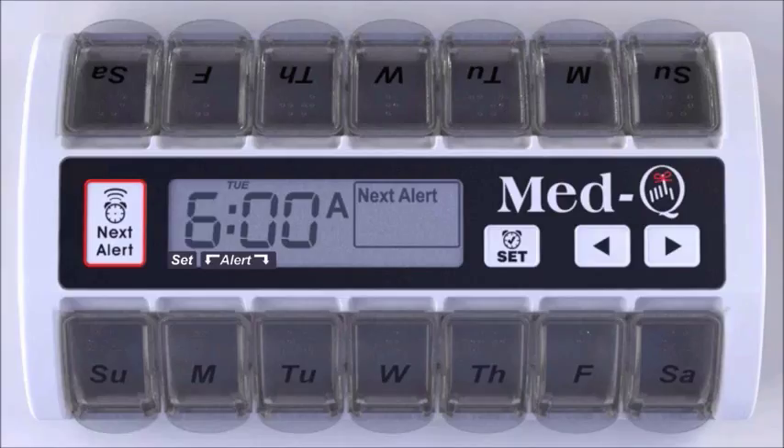Using the arrow key, simply scroll to the correct hour. Release. Press the Set button. The minutes will start to flash. Using the arrow key, scroll to the correct minute and release. Press the Set button.